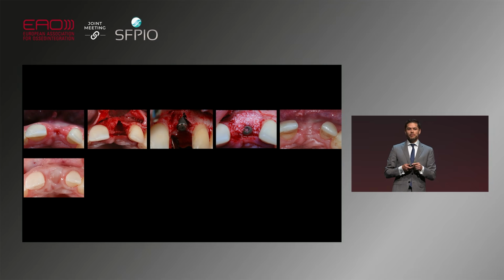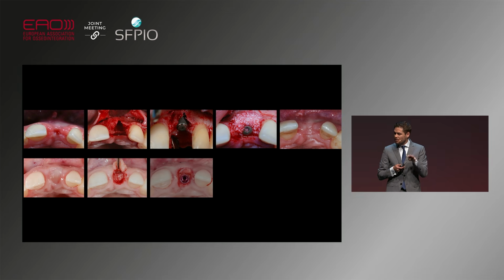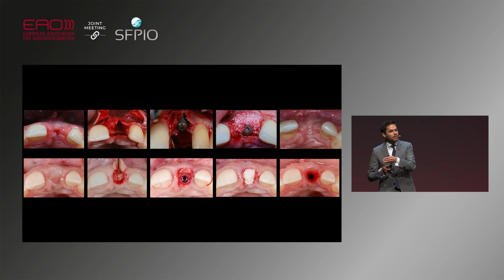But if at the time of implant placement, I perform a ridge preservation procedure, I'm coming back anywhere from 4 to 6 months, depending on the type of defect, and I'm performing a minimally invasive surgery. That is, I'm just using the crestal tissue to further bulk the buccal aspect, and I'm placing an implant that is placed flapless, and then afterwards, I'm using, again, a customized healing abutment to support the soft tissue. So when the case above has very complex treatments that take a long time, I'm using very simple interventions with very low morbidity for my patients and having yet very good results clinically.